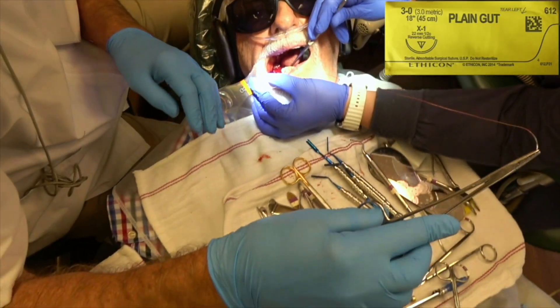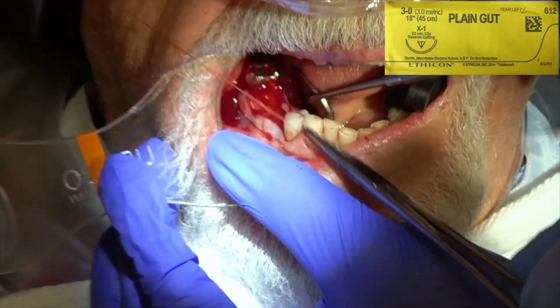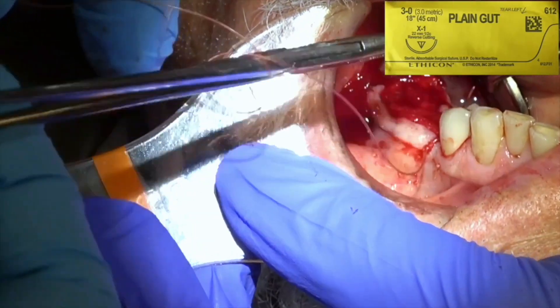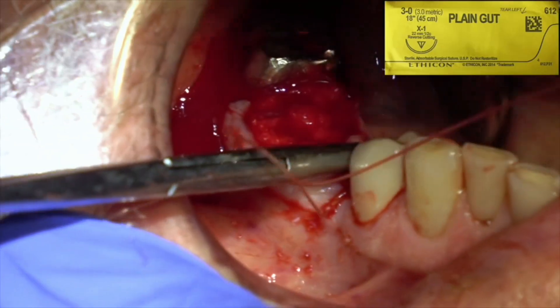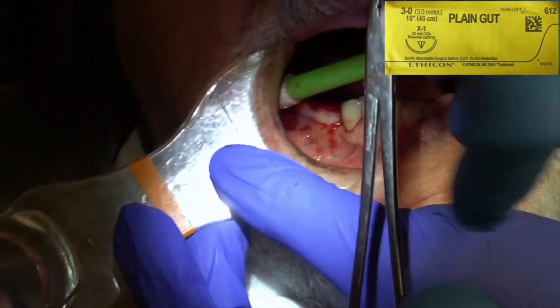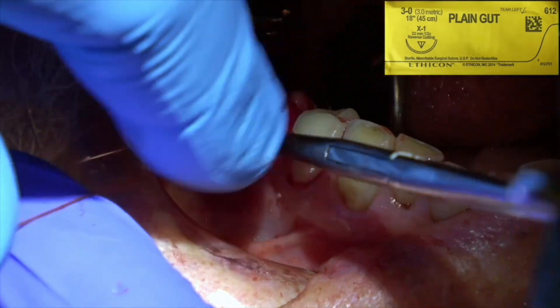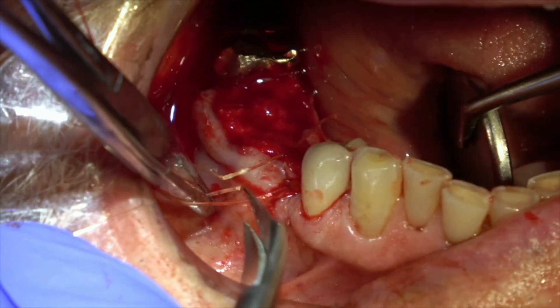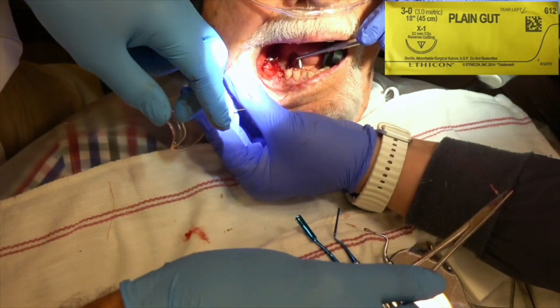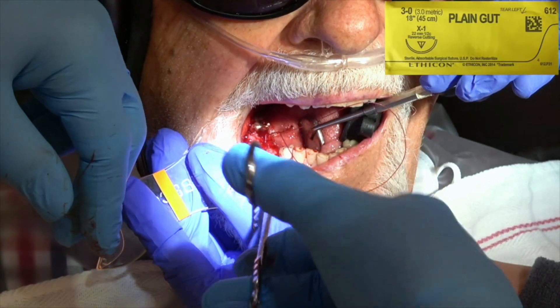I've placed two Osteogen plugs in the sockets and you just plug it in with the plugger. Then I'm going to put two or three sutures — you don't have to use a membrane. I used to use granular bone graft and PRF, which I liked, but this is so easy and so effective. I even use this for wisdom teeth and regular extractions. I call patients at night thinking they're going to have pain because it was a difficult extraction, and every one since I've been using this says they have no pain and no bleeding. One patient who had two difficult teeth out said she didn't even feel like she'd been to the dentist.